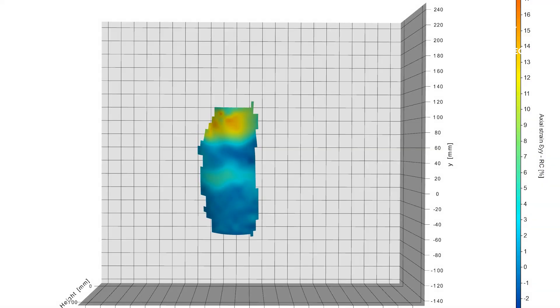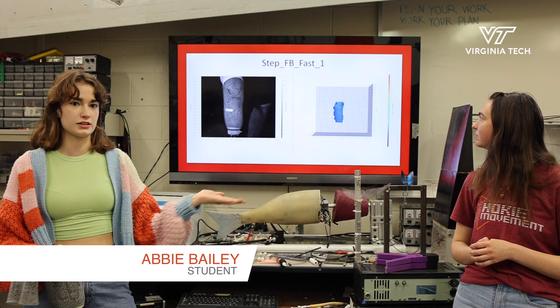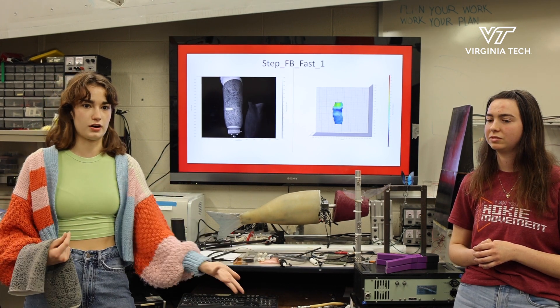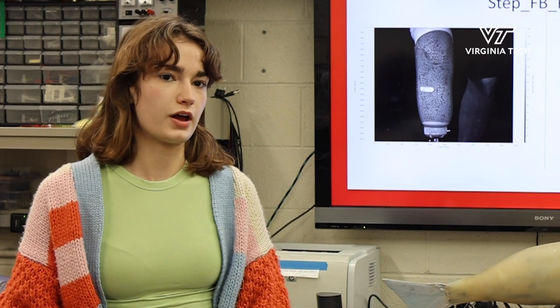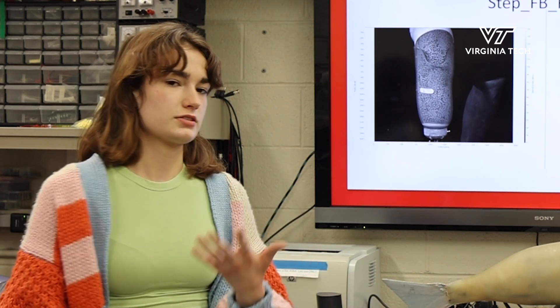A big subset of aerospace is structural analysis, and this DIC testing is especially helpful with structural analysis when you don't want to be interacting directly with the body that you're analyzing. Because we're one of the first teams to try to use it in this sort of way, it's a big step forward for this type of analysis in general.